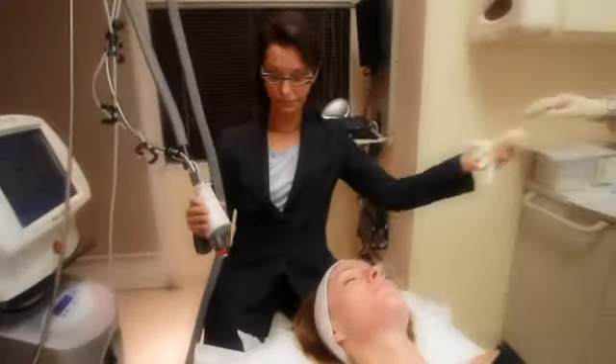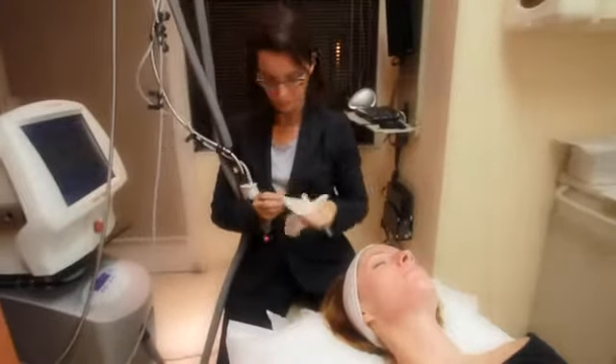The process we're doing today is called the thulium laser. It's a specific wavelength that cleans up and repairs the top layers of the skin.